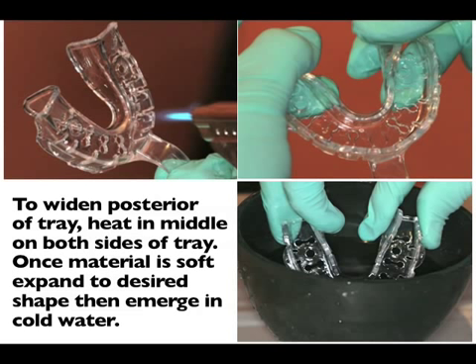Therefore, these are thermoplastic and you can heat shape these. This particular slide shows that I've heated in the anterior segment, rapid strokes, 5 to 10 seconds. I then have spread it open to accommodate the wider ridge in back, put it in cool water, let it re-solidify.